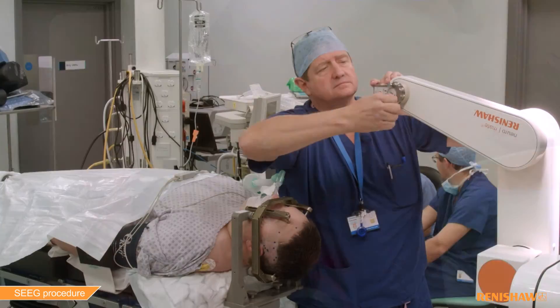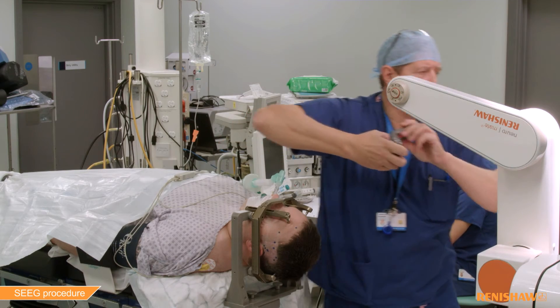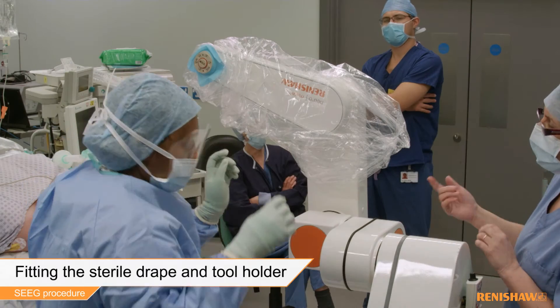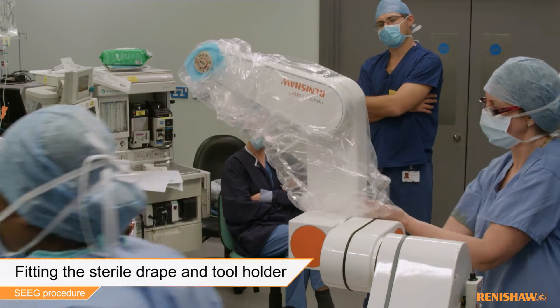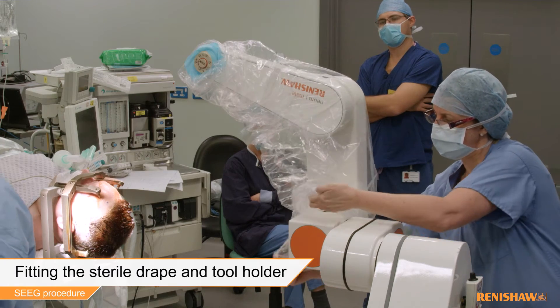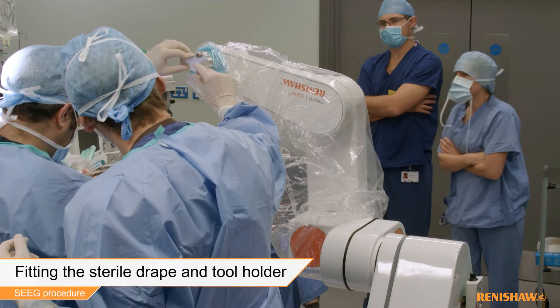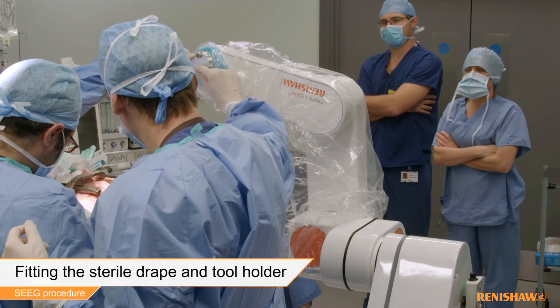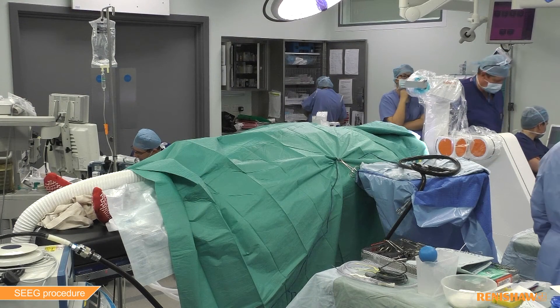Once all the trajectories are marked, the laser tool can be removed and replaced with the standard tool holder. This holder acts as a precision guide for the instruments and tooling used during the procedure. The surgical team are now ready to proceed.